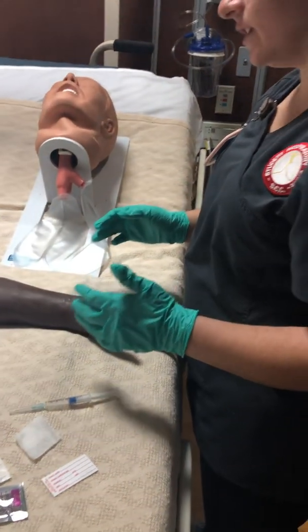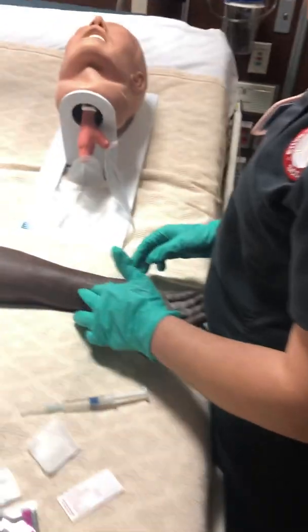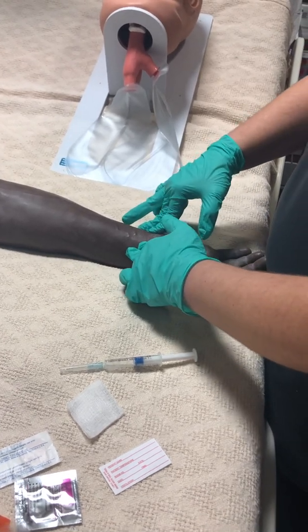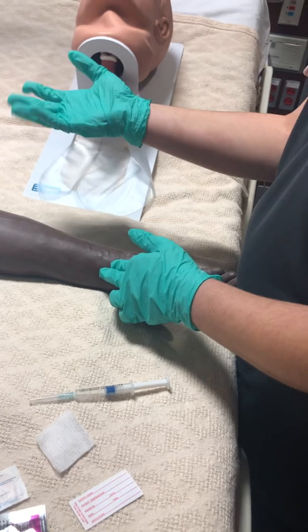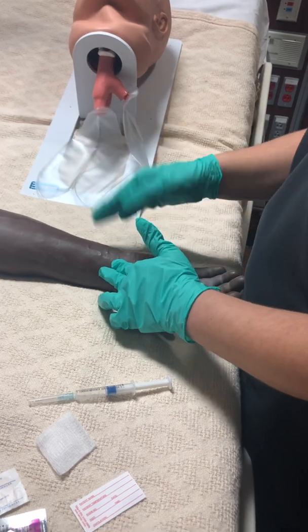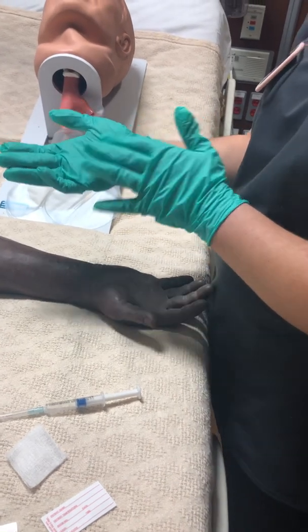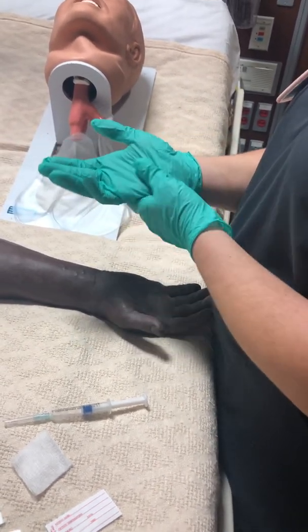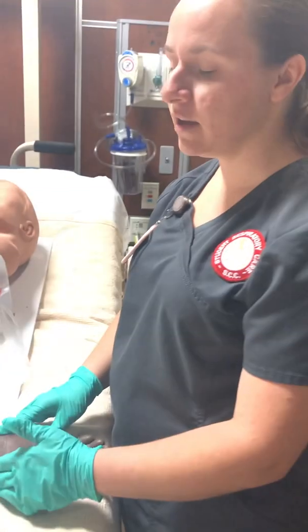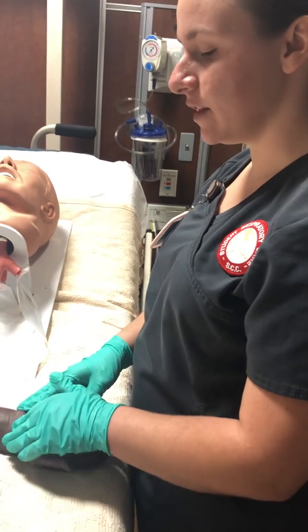First I'm going to do the modified Allen's test. I need to check to make sure they have a good flow. I occlude the radial artery and the ulnar artery. While I hold those down, I have the patient make a fist 3 times. On the 3rd time, I release the ulnar artery and see what their skin looks like. I need to make sure their skin flushes back in 3 to 5 seconds. Once their skin comes back, I always want to use the non-dominant arm. If their flow doesn't seem okay, I can check the dominant arm and do the same thing with the modified Allen's test.